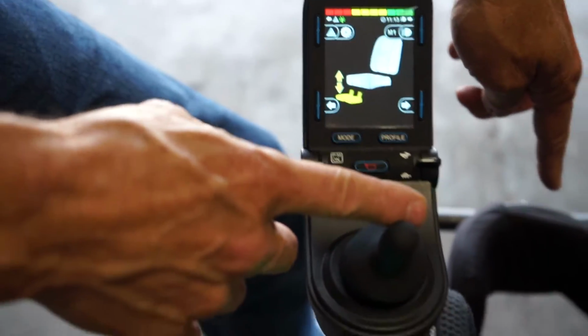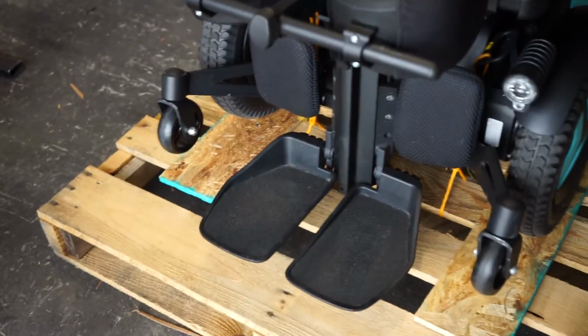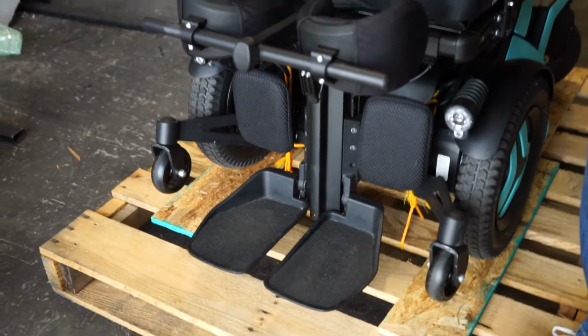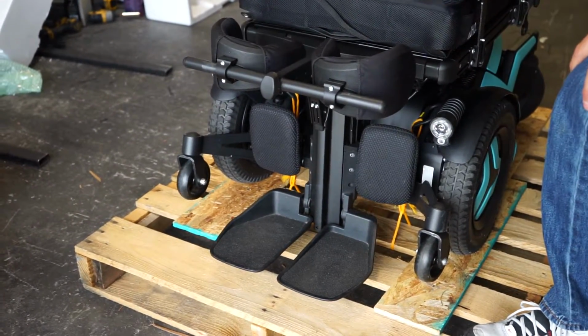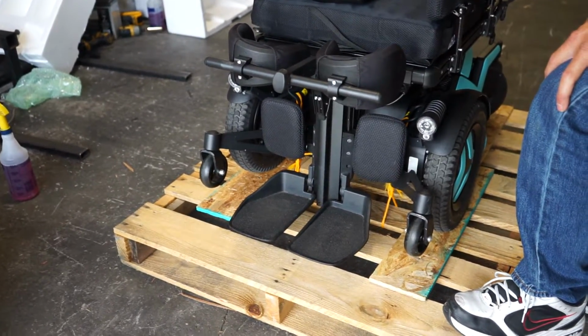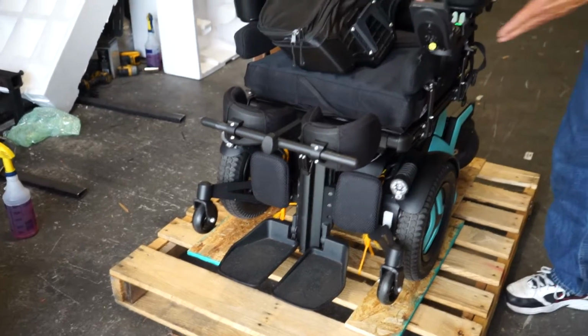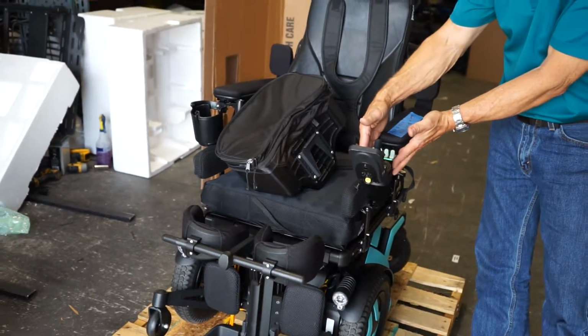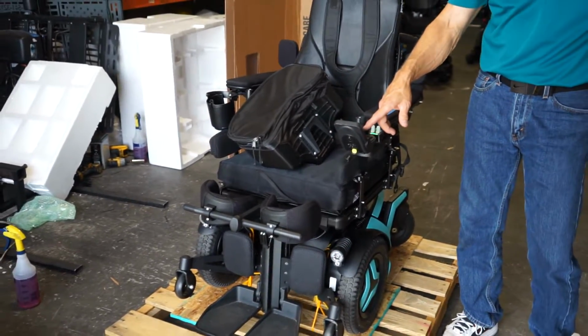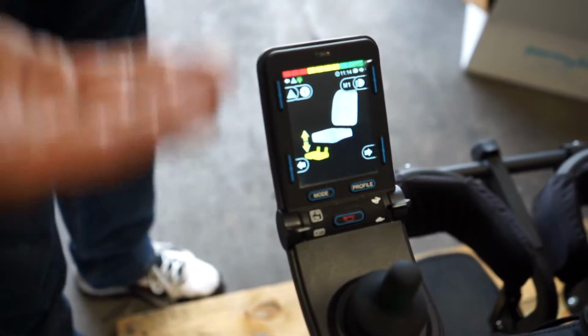you can see the foot plates. If you look in the front of the chair, you can see I'm going to go up with them. You can see the foot plates going up. You can see the foot plates going down. So the only function that you cannot do through the switch box right here is the up and down. You have to do it through the joystick, and it's the only one that shows on the joystick. Again, it has to have the arrow up and down. That's the feet going up and down.